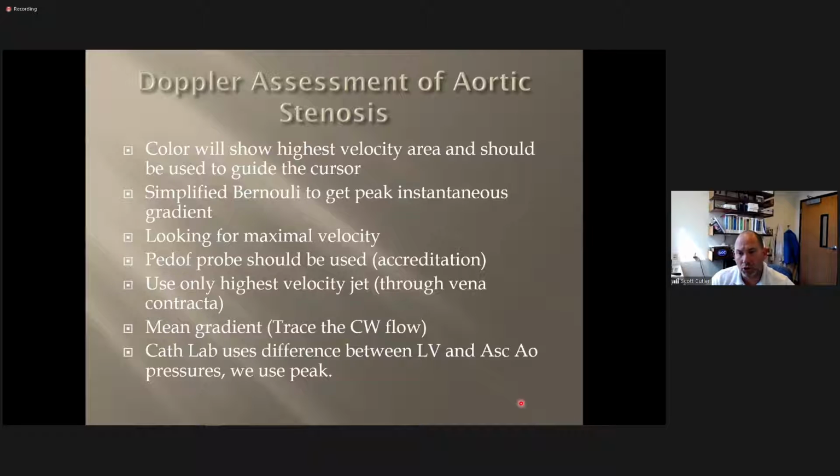Okay, if we do in fact have stenosis, by lab accreditation, if a lab is accredited through the ICAEL organization, you have to do a PEDOF measurement with the right parasternal. So on the right side, a little bit higher, you need to take a PEDOF sample of that for lab accreditation purposes. So that's required on all aortic stenosis studies. So that's your blind PEDOF probe.